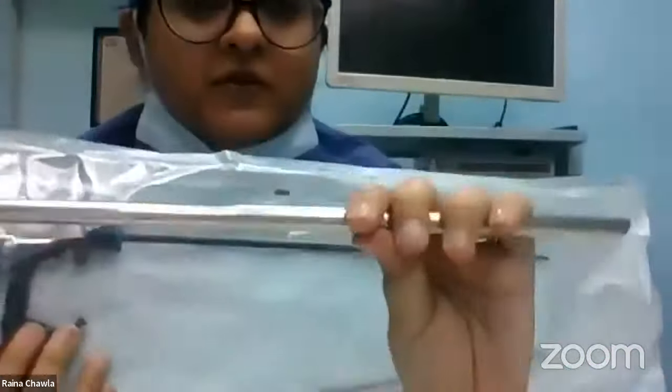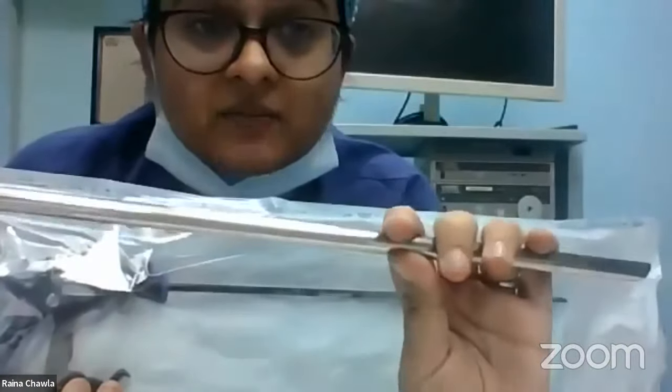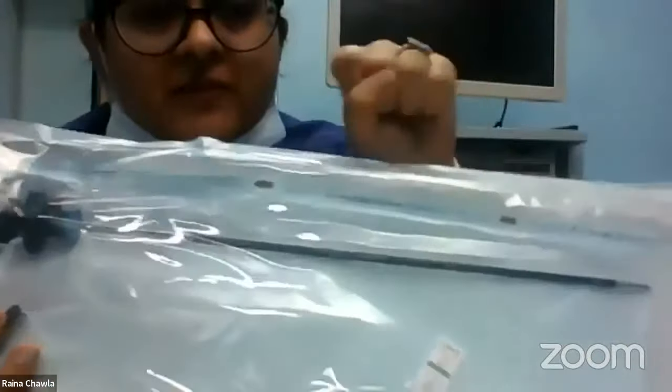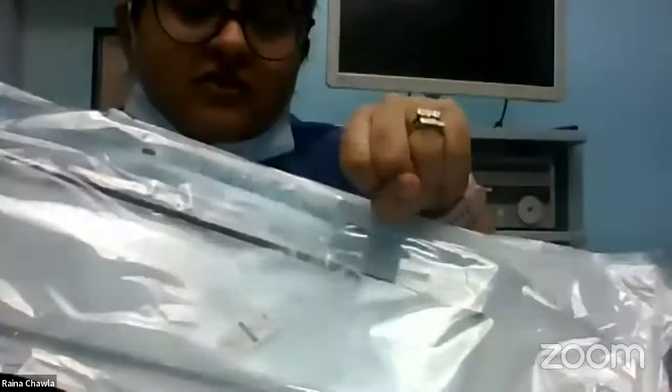Similarly, we will create secondary ports, 2 or 3 or 4, depending on whatever surgery we are doing. And through those ports, we'll introduce laparoscopic instruments like this. Okay, so this is a laparoscopic instrument. You can see it's much thinner than the scope. So the scope is usually introduced through a 10 millimeter port. The diameter is around 1 centimeter. And the laparoscopic instruments are introduced through 5 millimeter ports. Okay, so these are called secondary ports. Again, a sheath will be there through which this instrument will go.